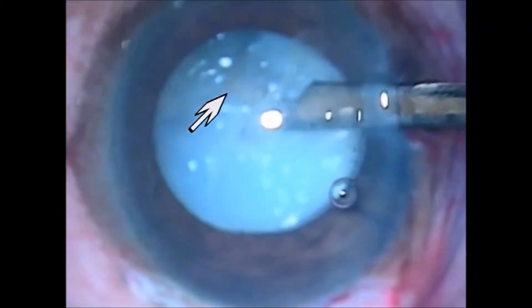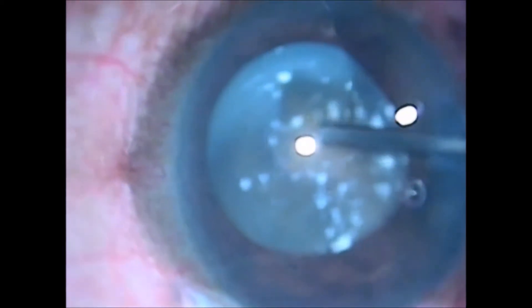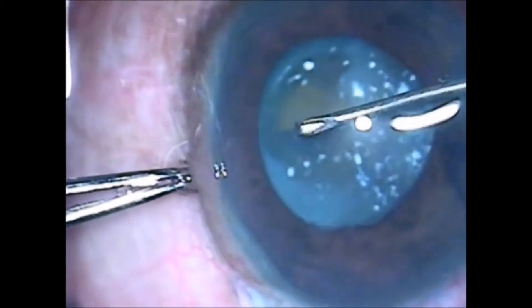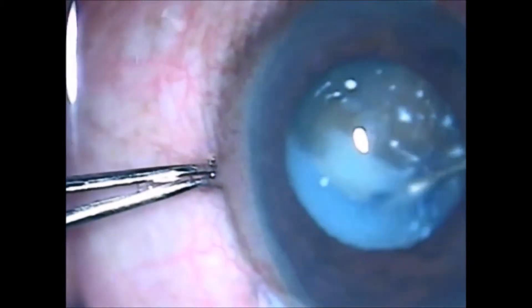Now let's see a scenario of a mature cataract with liquid cortex. After an initial nick with a 26-gauge needle, the liquid cortex is washed and removed with a Simcoe cannula. Then high-density viscoelastic is injected into the bag and anterior chamber to provide support for completing the capsulorexis.